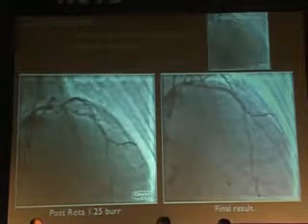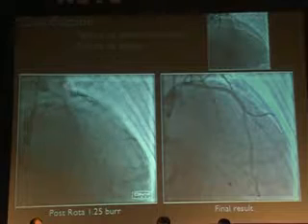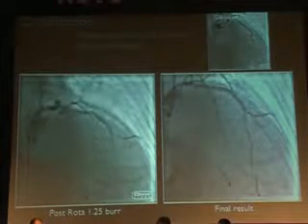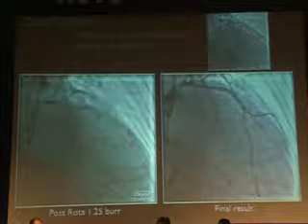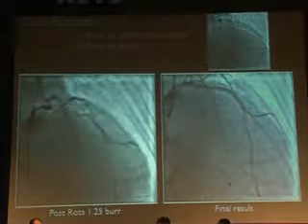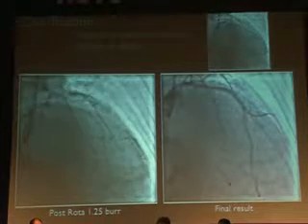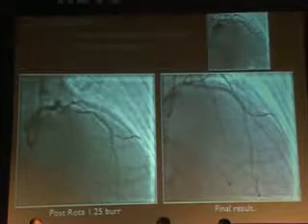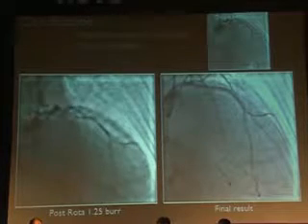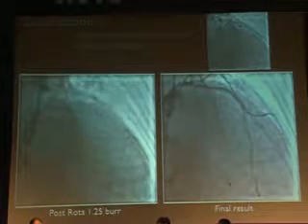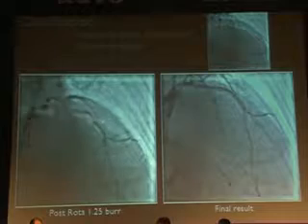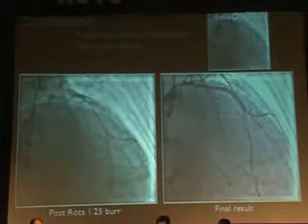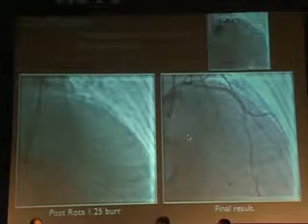This was around two months after the index attempt. We used a 1.25 burr. Post-burring, you can see a little wire bias causing a slightly irregular appearance — but that's okay, that happens with rotational atherectomy. The trick is to stop at this point and not go with higher burr sizes, or else you risk perforations. After that, it was simple to deploy the stent. This is the final result.